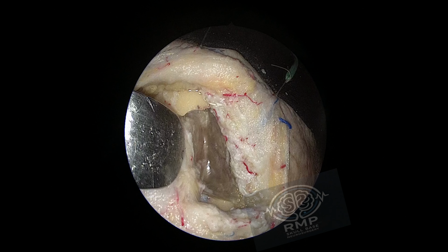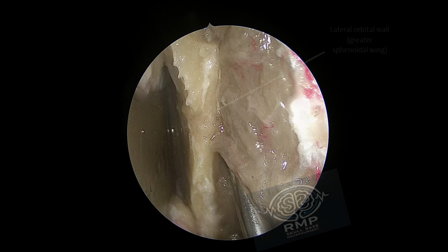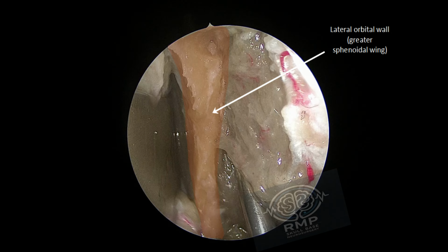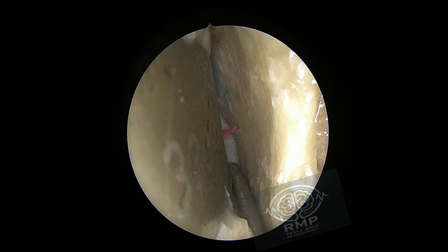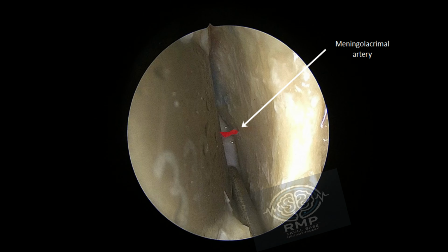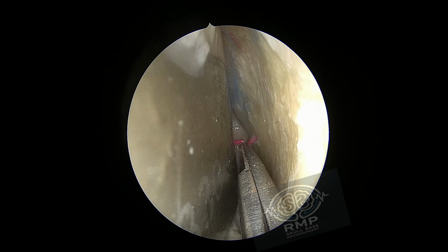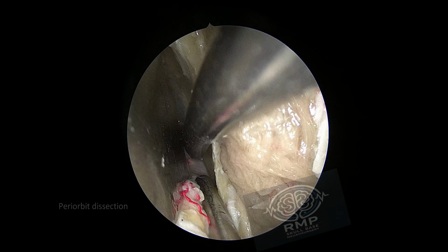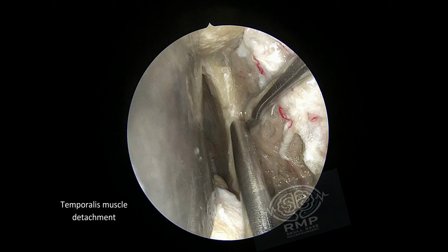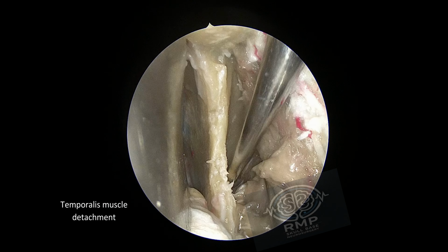The periorbita is dissected subperiosteally from the greater and lesser sphenoid wing. A reliable landmark in the lesser wing is the meningolacrimal artery, which should not be confused with the meningorbital band. This is a branch that communicates the ophthalmic artery with the meningeal system and needs to be coagulated and severed in order to avoid intraorbital bleeding.